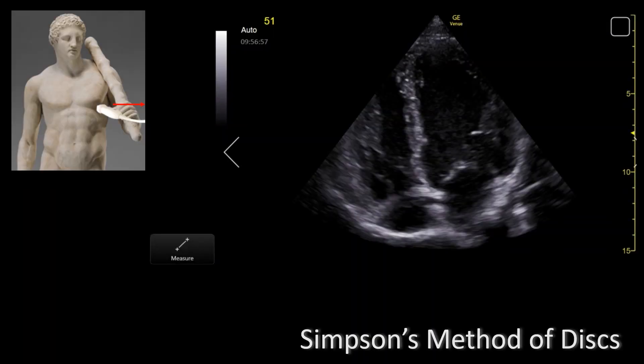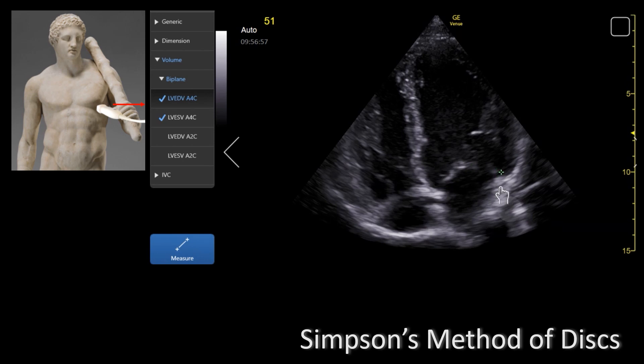Let's make some measurements. First, you need to acquire the best apical four-chamber and apical two-chamber views that you can get and save them. Then select the measure button on your ultrasound and then the trace area option. When tracing the LV volume, you want to measure the end-diastolic volume and the end-systolic volume. End systole is defined as the frame after aortic valve closure or the frame where the cardiac dimension is the smallest. In this case, we don't see the aortic valve, so we will determine which frame the LV looks the biggest and the smallest visually.